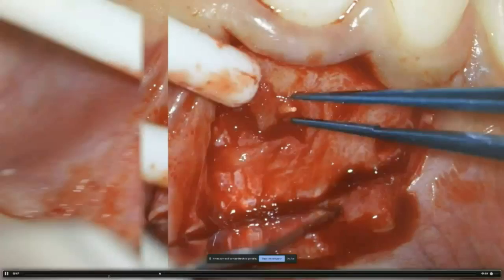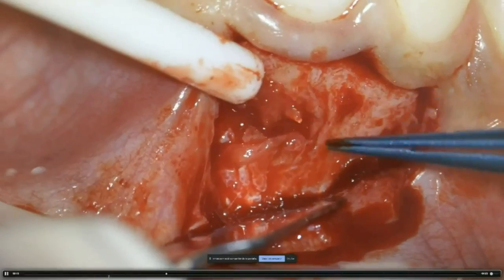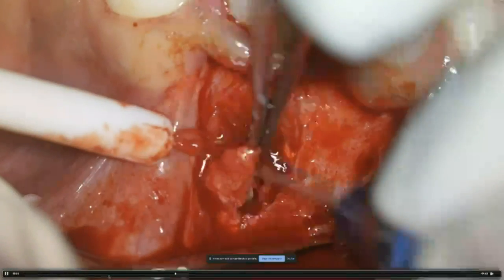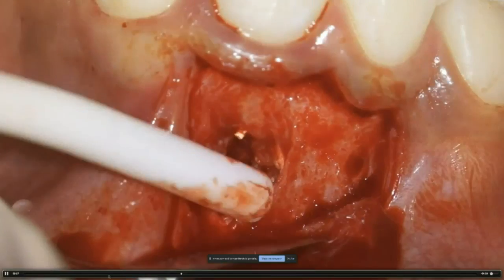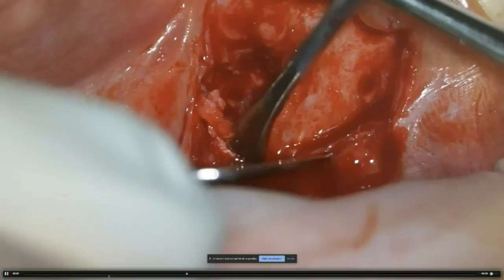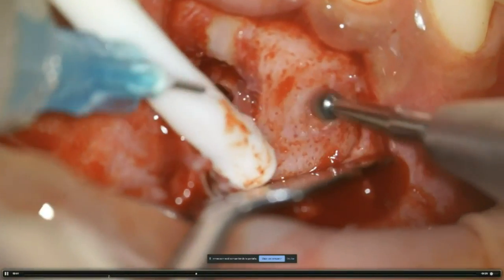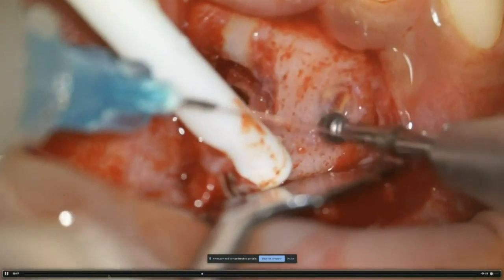As you can see there, you can see part of the gutta percha that was out of the root because of the resorption, as you can see also in the periapical x-ray. So there, I'm cutting all the granuloma tissue, removing everything, trying to be the most conservative possible. But remember that we also have a big lesion of 1.2. So in this same surgery, I'm trying to open and remove just a little bit of bone, so it'd be easier for me.